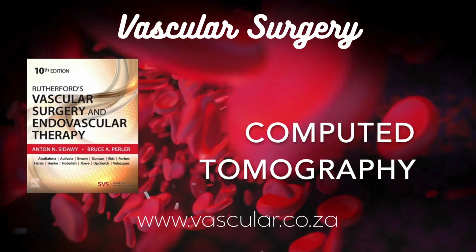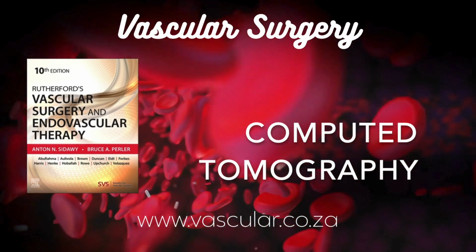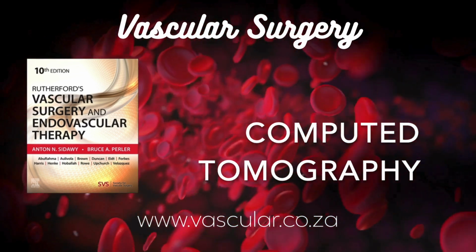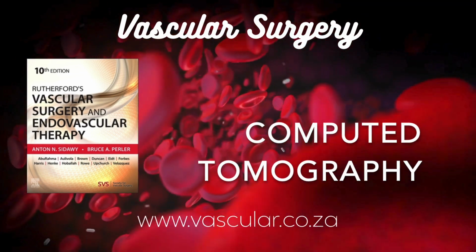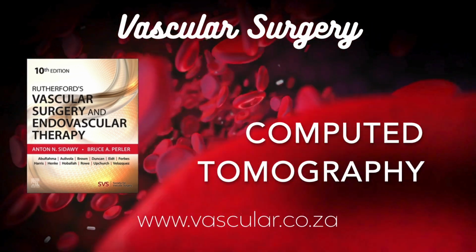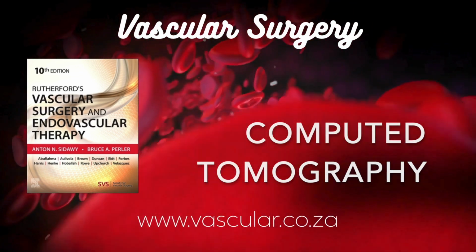Finally, the reconstruction algorithms. Filtered back projection versus iterative reconstruction. Big difference. Huge difference, yeah. Filtered back projection, FBP, was the original workhorse. It's a direct mathematical method to create the image from the projection data. But it needed filtering. Right. The raw reconstruction is often a bit blurry, so they apply filters or kernels to sharpen it, but there's a trade-off. Kernels that sharpen the image a lot, high spatial resolution, also tend to amplify noise. Kernels that smooth out noise also blur fine details. You had to pick the best compromise kernel for the task, like a sharp bone kernel or a smoother soft tissue kernel. Yeah, okay, necessary compromise back then.